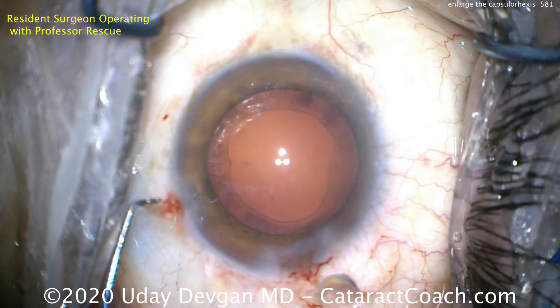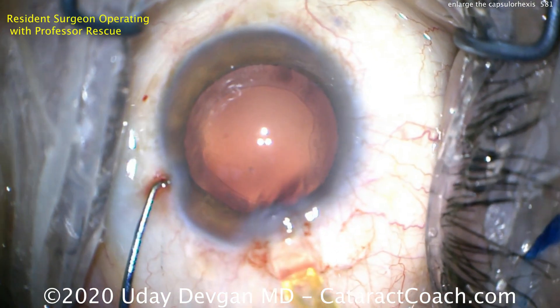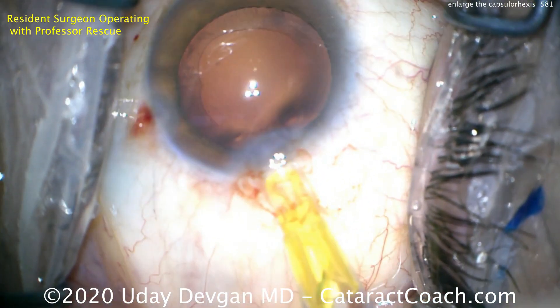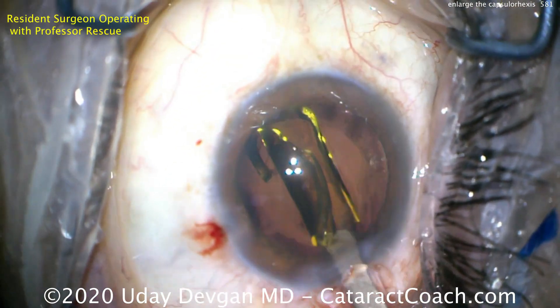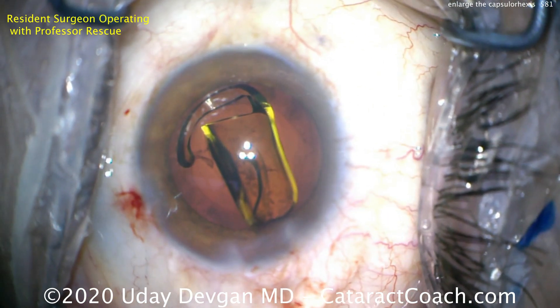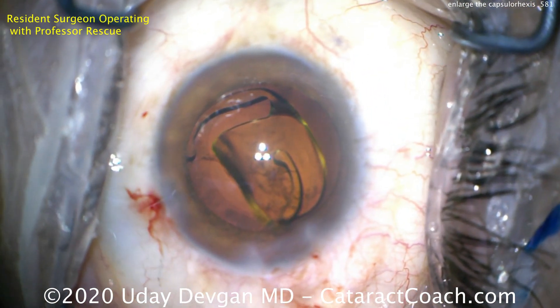Now we have a normal five millimeter capsulorrhexis and it's fully intact — there are no weak edges because the scissors cut tangentially. Here is the very end of the case. The capsular bag has been inflated with viscoelastic, the IOL is now being delivered, and we can see the capsular opening is appropriately sized at five millimeters and very nicely centered.